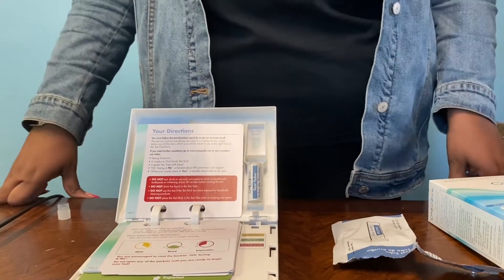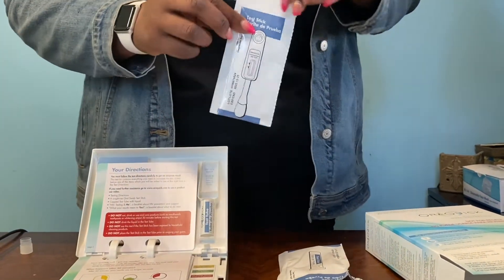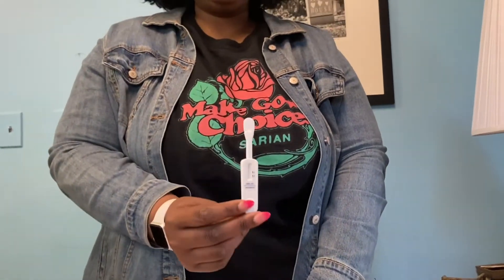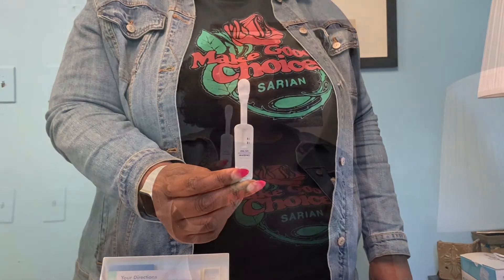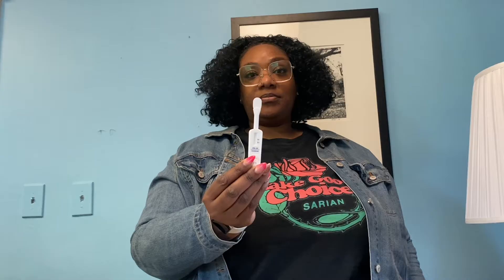Now take out the next packet, labeled test stick. Tear open the packet and remove the test stick, being careful not to touch the pad with your fingers. The great thing about this test is that there's no blood involved. You just gently swipe the pad along your upper gums once and your lower gums once. Make sure you swipe each gum only once or your results could be wrong. You can use either side of the pad.